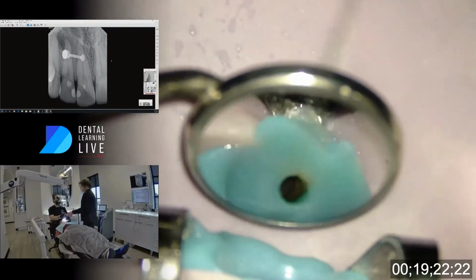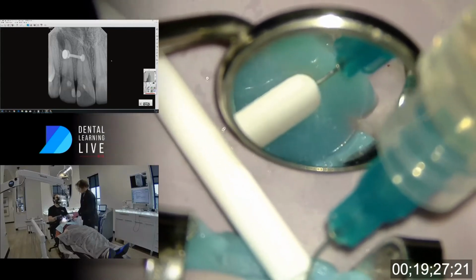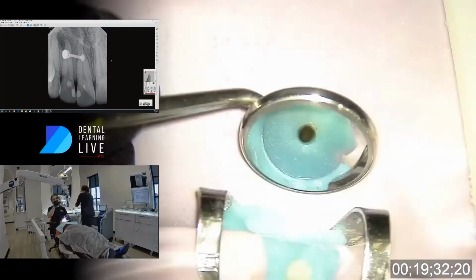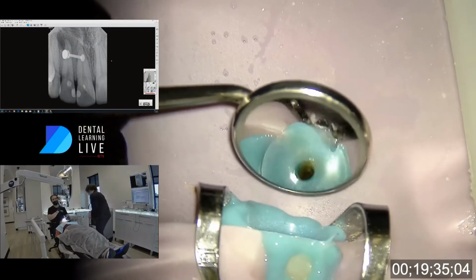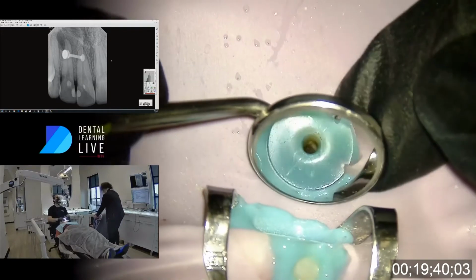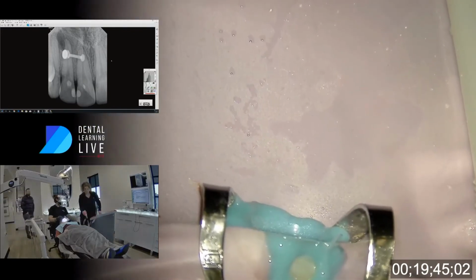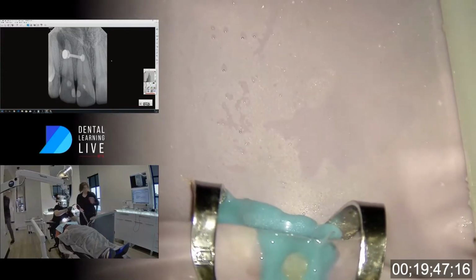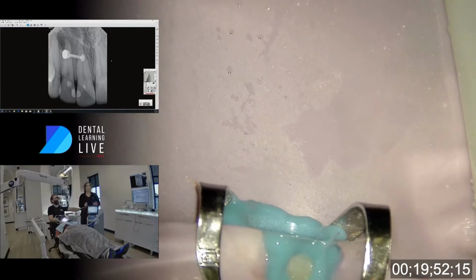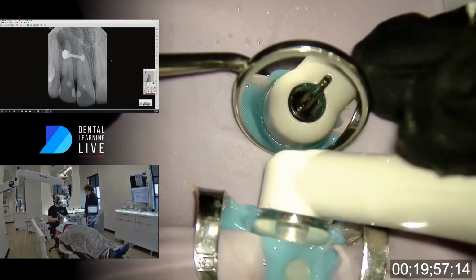So now I can set up, bring over the handpiece. So Lindsay, if you want to go ahead and bring that over here. And what she's handing me is GentleWave. Let's see. Now, this console over here on the side is going to go through a degassing phase. And so I'm going to set this up.